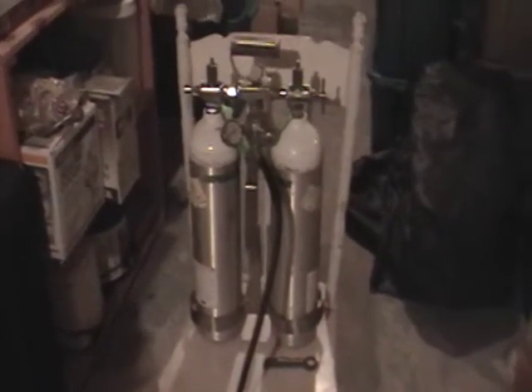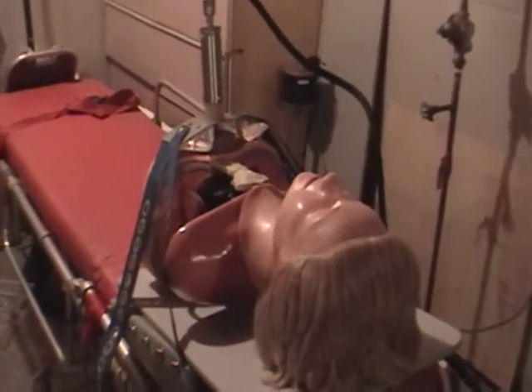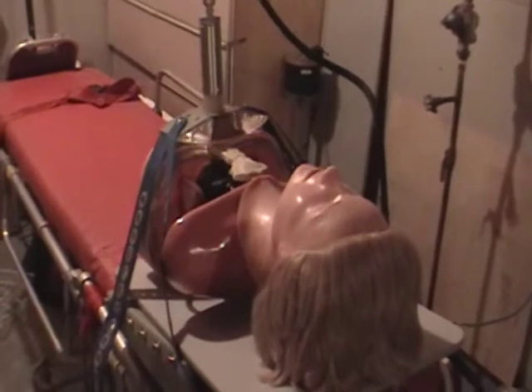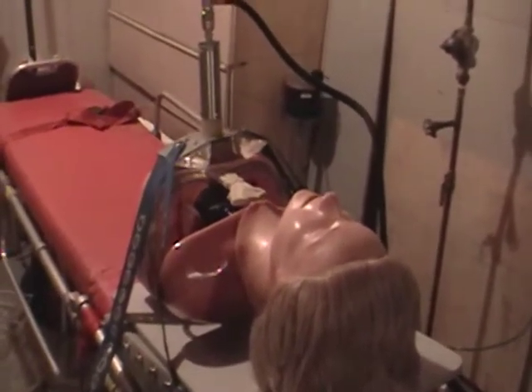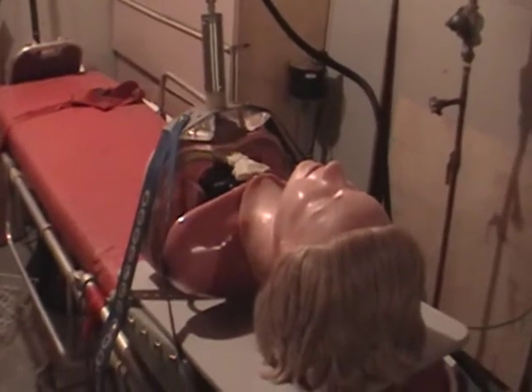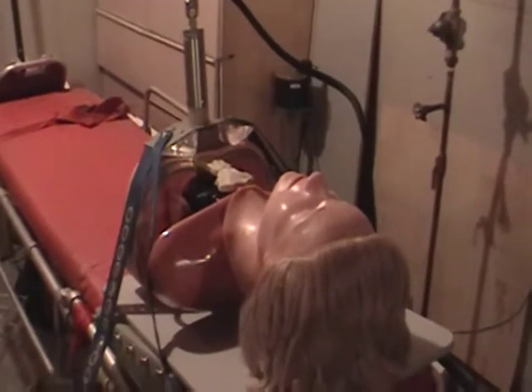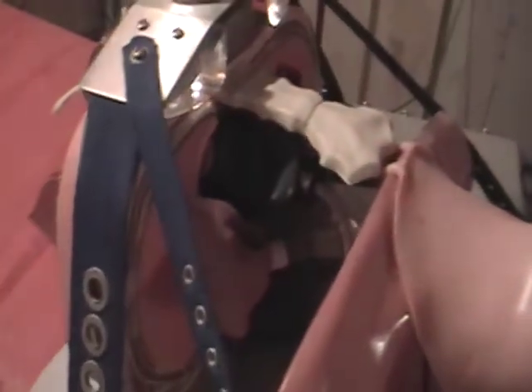So what are those oxygen tanks attached to? Maybe some of you have worked with one of these before — it's a handy dandy thumper. It still works well, but certainly does not do compressions as fast as we require nowadays. It runs at about 65 to 70 a minute; we're looking at about a hundred a minute now. This is our old Resusci Annie.